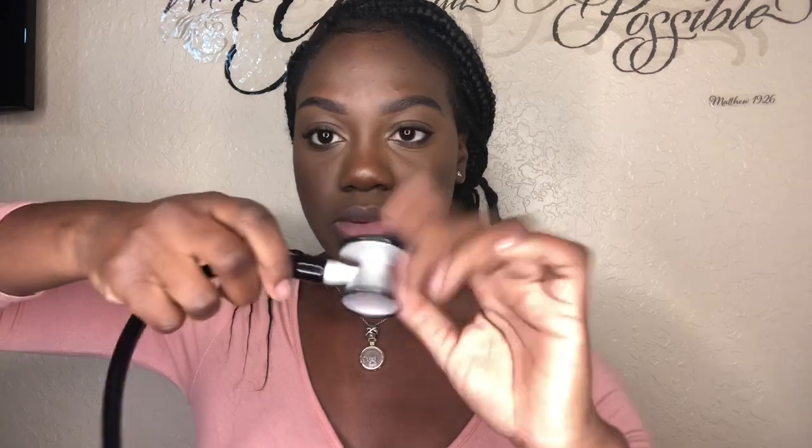So this is the bell and the diaphragm and it does turn like normal stethoscopes — on and off. It's black, which I like, and it has big ear pieces. These ear pieces are not uncomfortable like a lot of other stethoscopes, some of which can be very uncomfortable and hard. It fits nice and comfortable.